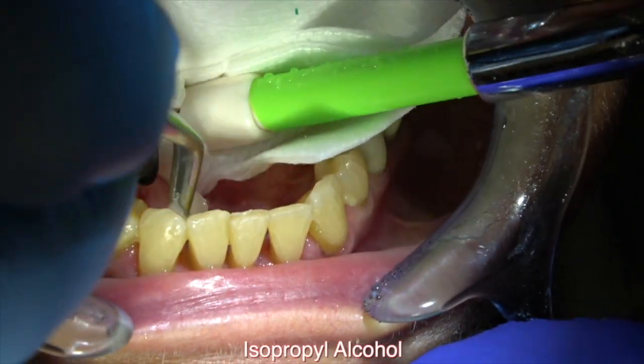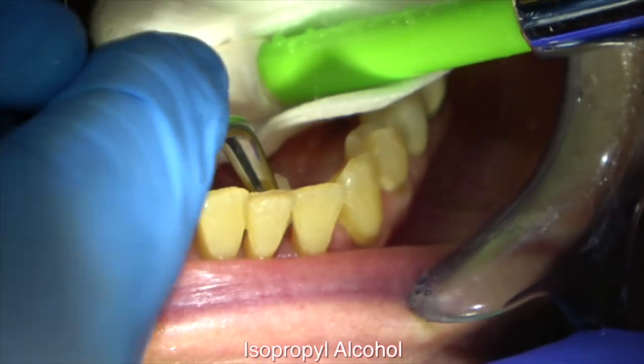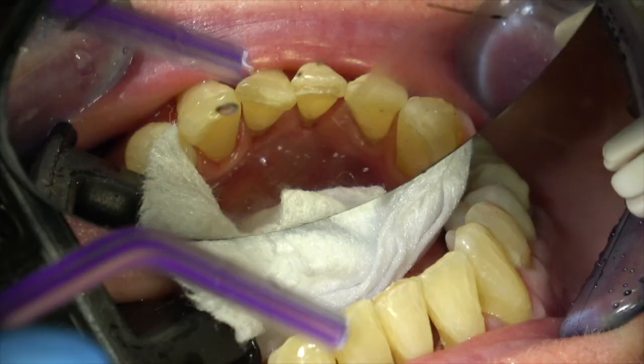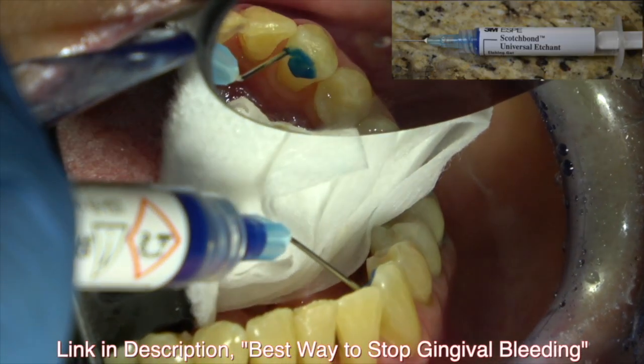You can torque it a little bit. Now I'm wiping the lingual of the teeth with isopropyl alcohol just to clean them well. You can see there's a little divergence right here, so I polish that with a football diamond.